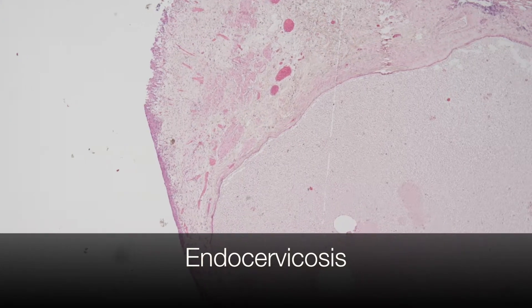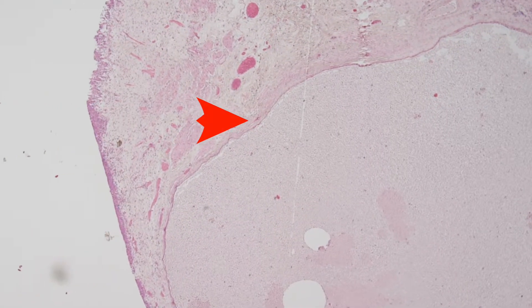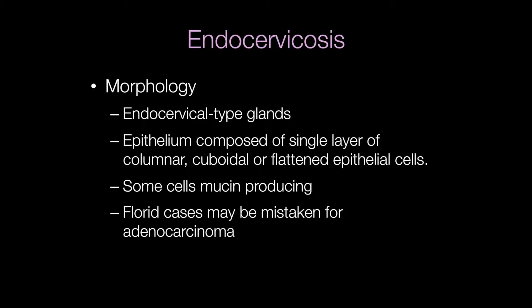This is a low-power view of a focus of endocervicosis in the bladder. As the name suggests, endocervicosis is composed of endocervical-type glands, and these are lined by epithelium composed of a single layer of columnar, cuboidal, or flattened epithelial cells, and some are mucin-producing.